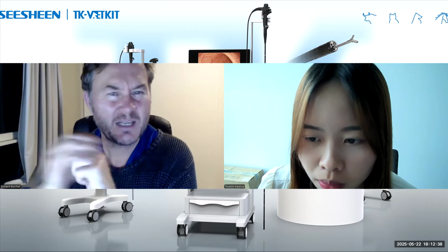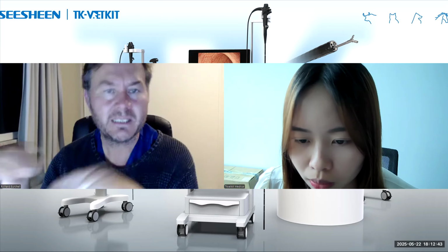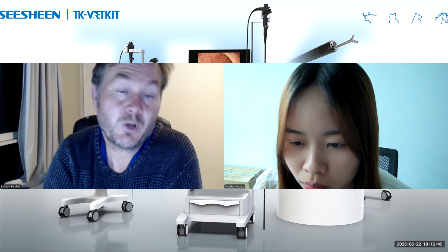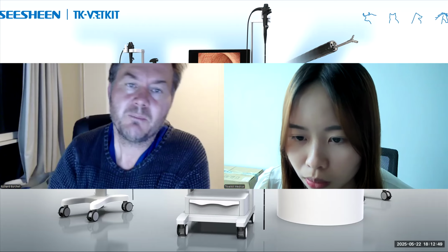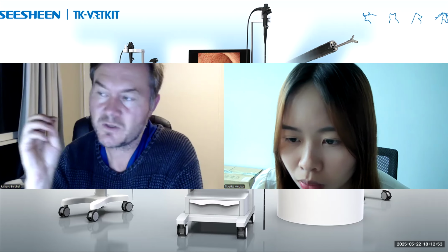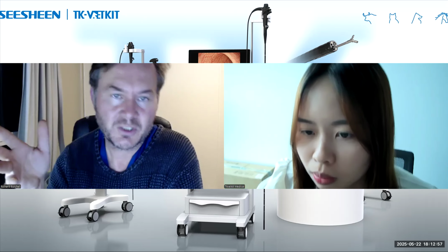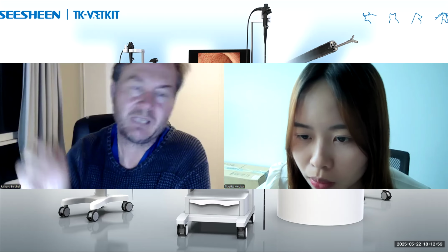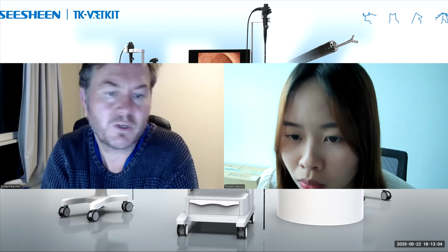So yes, you can, but you'll have a relatively limited ability to see the whole airway, because you can't really maneuver that scope. But with rigid scopes, you get wonderful resolution because they're glass. It's not a digital image, it's an actual physical image, so you get really good quality images.